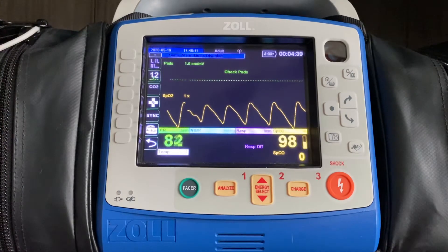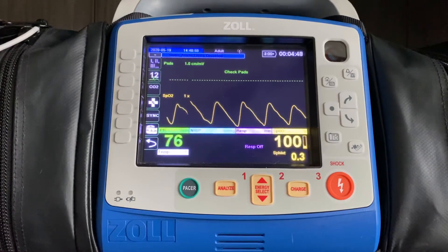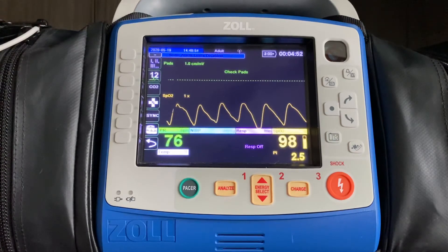The goal is for the PI value to be 1.0 or higher. That tells me as a provider that yes, this finger that I'm using for this particular patient is good, and I can trust that the other values on the screen are being represented accurately.